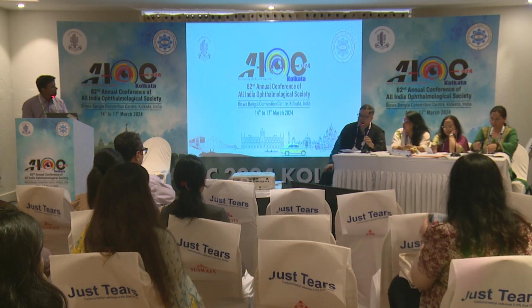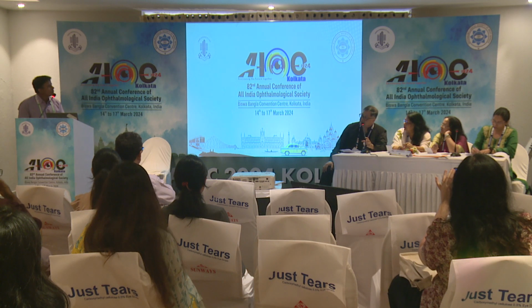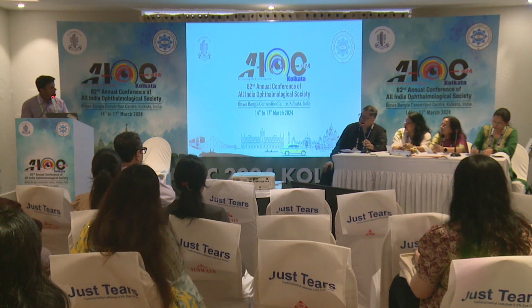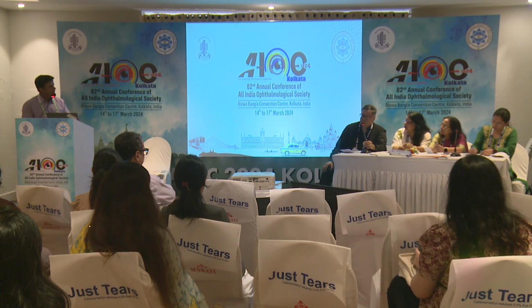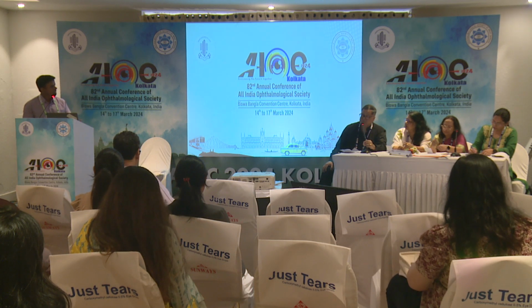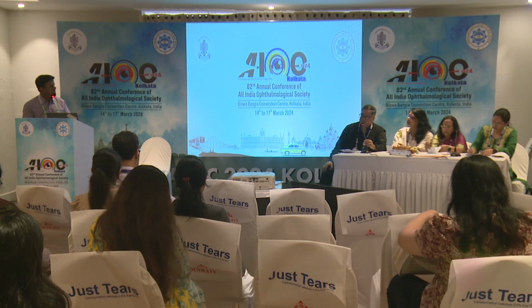What is the follow-up period for this? Pardon me, sir? Follow-up period. We have followed these patients only for 6 months, sir. This study is still going on, and beyond 6 months we are still in touch with these patients, and we will be following them for another 2 years, so that we can comment on the long-term stability of the IOL, sir.